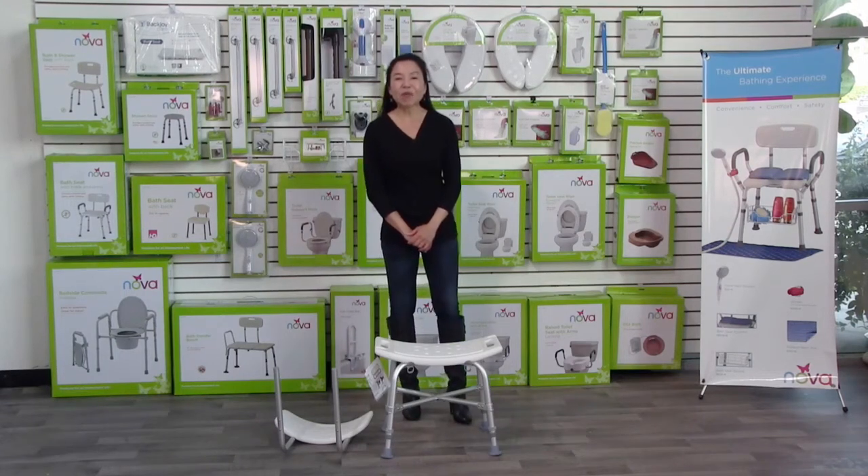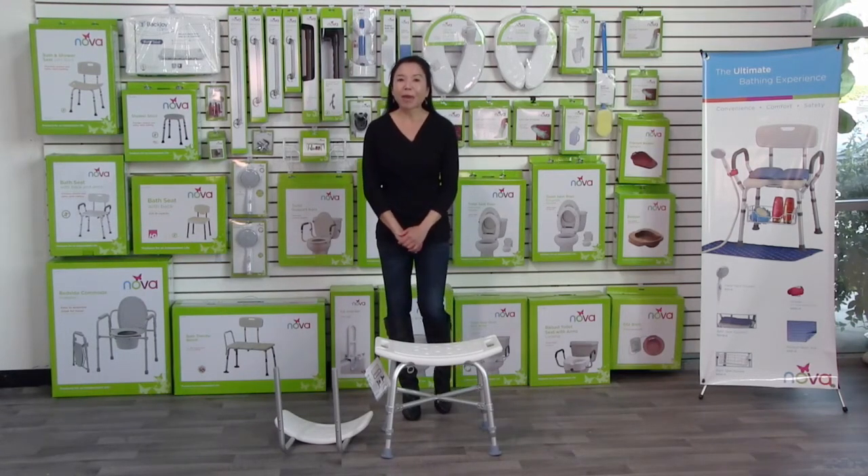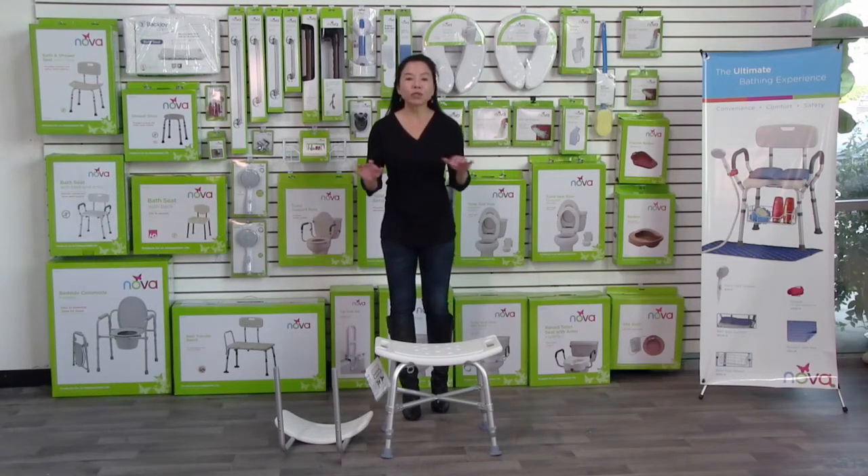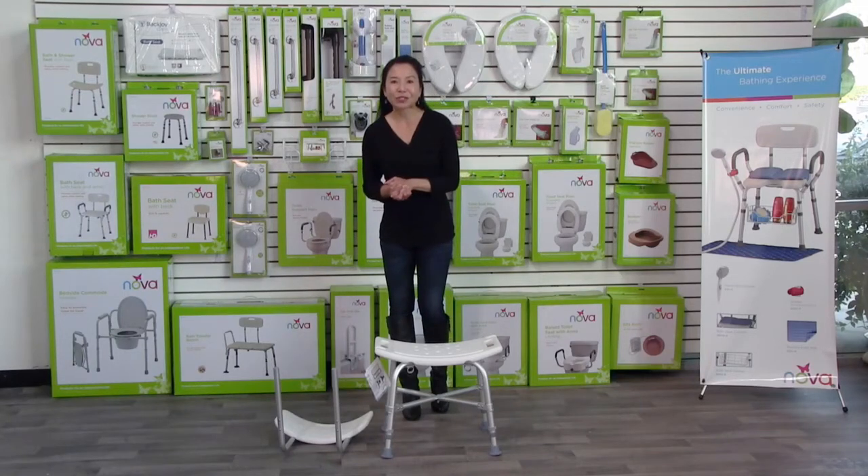This video is about the Nova 9023 bath seat with back, with 500 pound weight capacity. I'm going to show you the quick and easy tools-free assembly and then some of the great features and benefits.